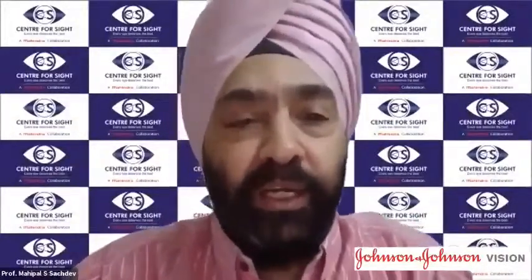And not everyone is like us. Mortals are not equivalent to what she does. But I think obviously the basic principles are fantastic, because there is a loss of support on one area and you have to go for traction, counter traction and hand over hand techniques as she has shown. But I think femtolaser obviates that, and I think for a common ophthalmologist who does have a femto, a lot of these problems would be solved by using a femto for doing a capsulotomy in such cases.